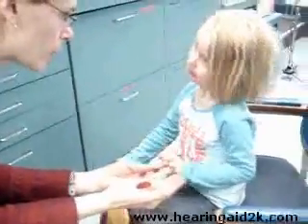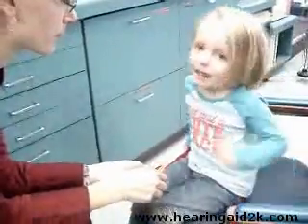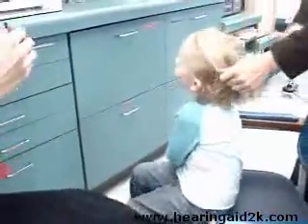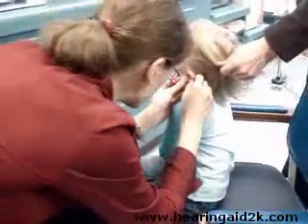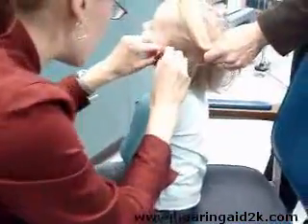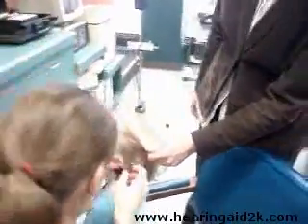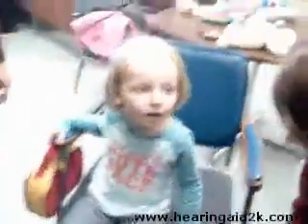We're going to do one ear at a time. Which ear should I start with? Okay, let's start with that one first. So Emily, I'm going to put it in your ear first and then turn it on — it's going to make sounds a little bit louder for you. I'll put the mold in your ear, and I'm sorry, I'm pulling her ear. Now I'm going to put the piece behind your ear. Are you ready?